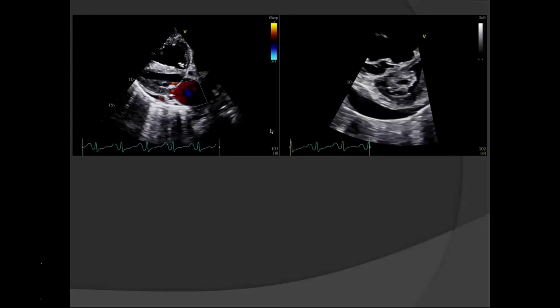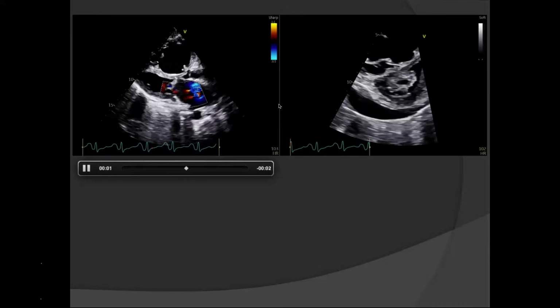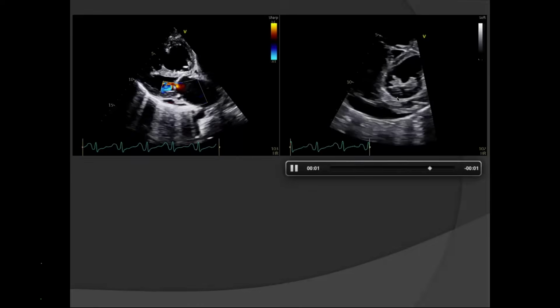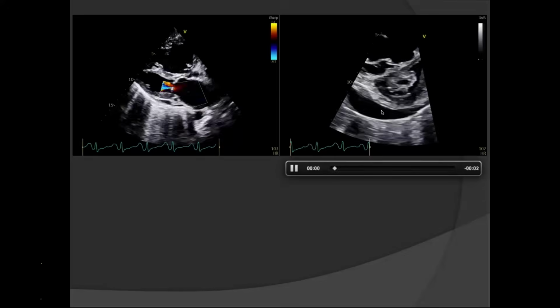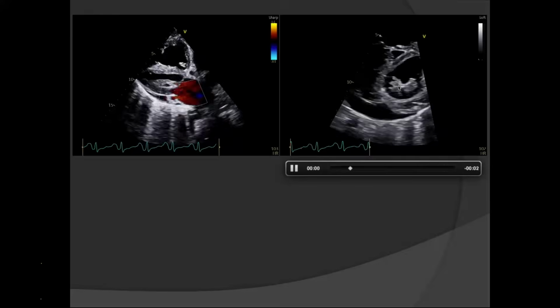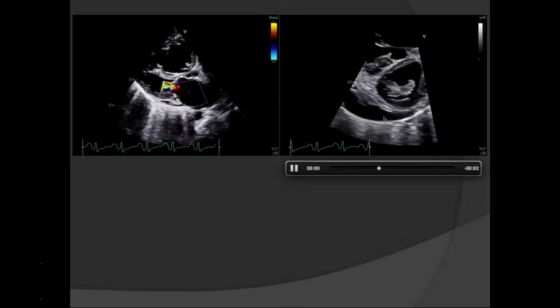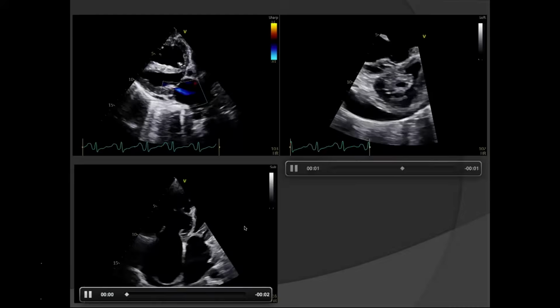So further images, just for your information, clearly mitral stenosis, small amount of mitral regurgitation, mitral stenosis confirmed in this short axis view. More pericardial effusion is visible here. Probably this patient has significant right heart failure, pressure overload causing pericardial effusion also. Further imaging revealed this image.